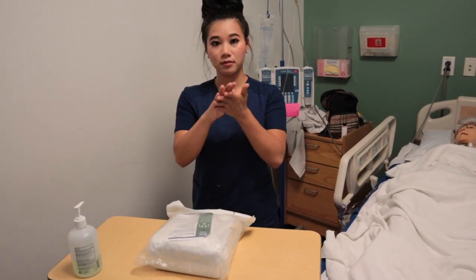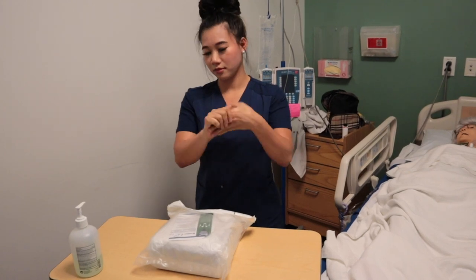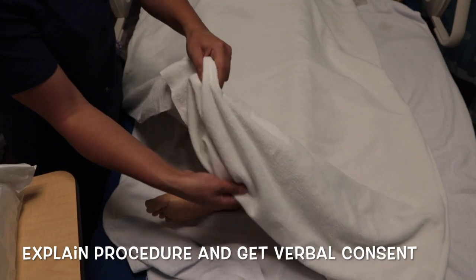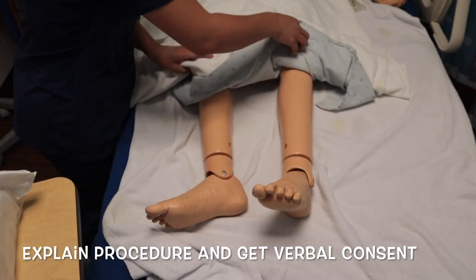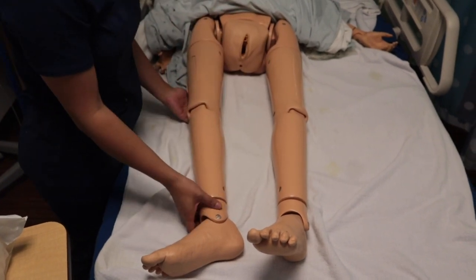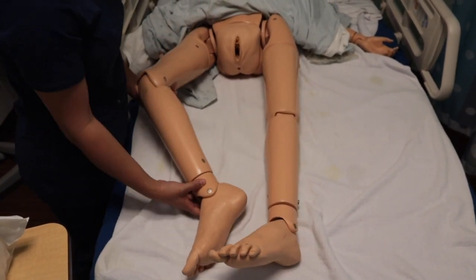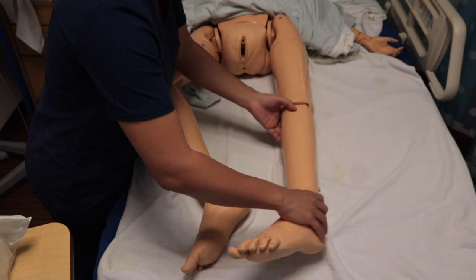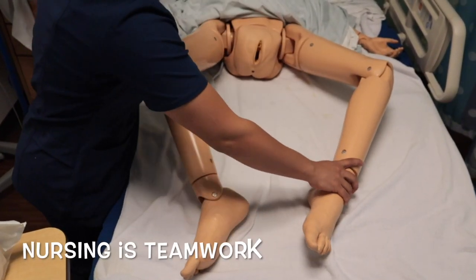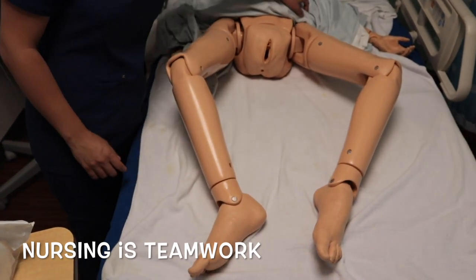Wash my hands and use hand sanitizer. Make sure to explain the procedure to the patient and get their verbal consent before starting. I am now lifting up the blankets to expose the peri area. I would then ask the patient to bend both of their legs outward and remind them to stay still. If they can't, then have the second nurse help you keep the leg still.